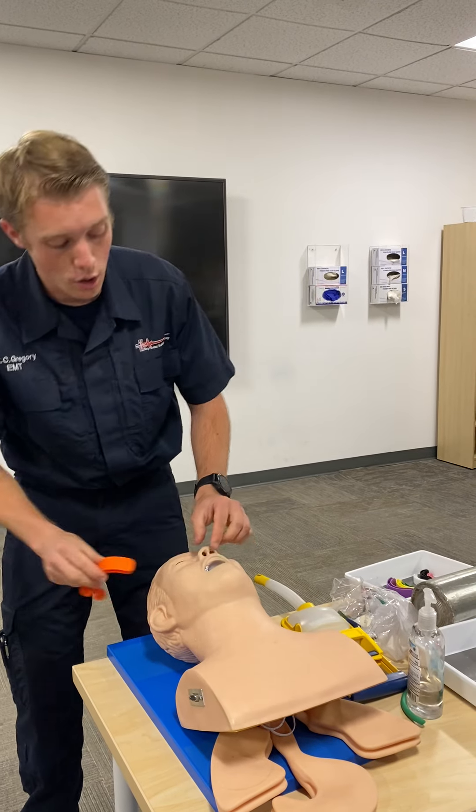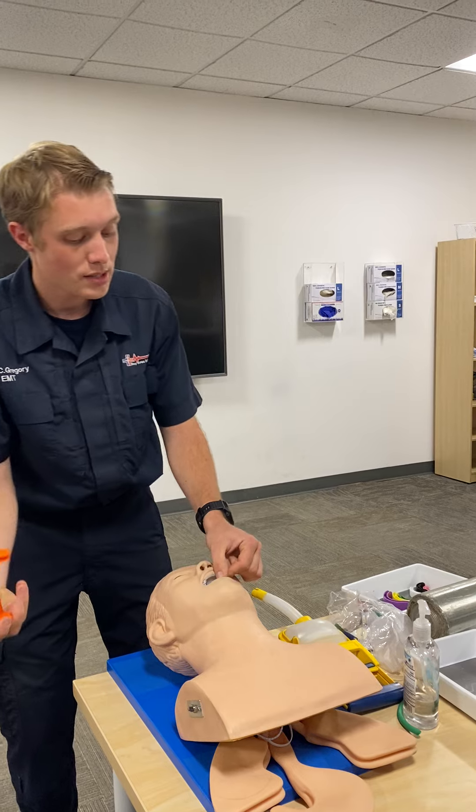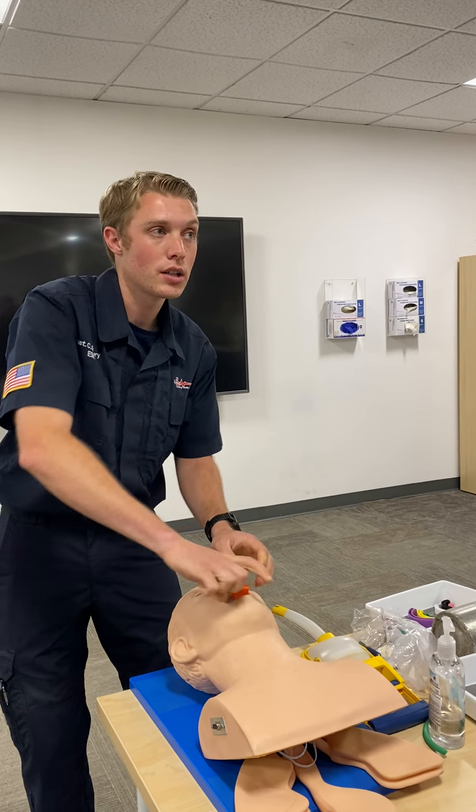Open, clear, maintain. I'm going to grab an OPA and measure from the corner of the mouth to the corner of the ear lobe — this one looks like the right size. I'm going to open up the mouth, come in from the side, and twist at that 90-degree mark to put it in.